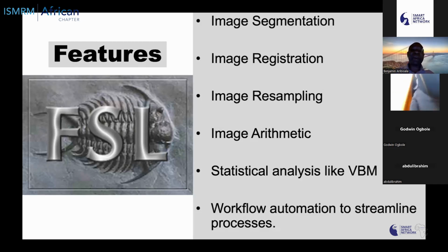The other type is when you do brain extraction, which is also called skull stripping, and there is a function called BET in FSL that lets you do that. So that's another form of segmentation, because you are removing the bit you don't want and retaining what you want to look at. So brain extraction is generally what it is called.